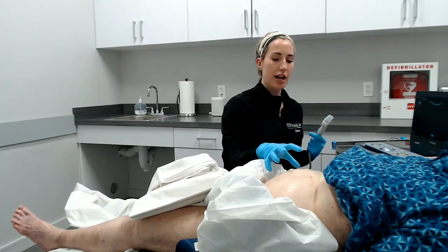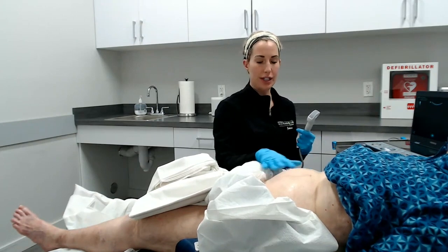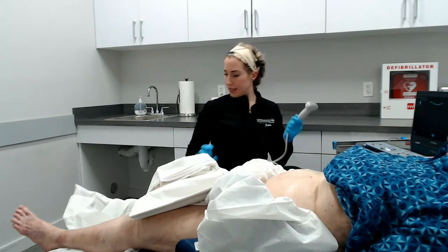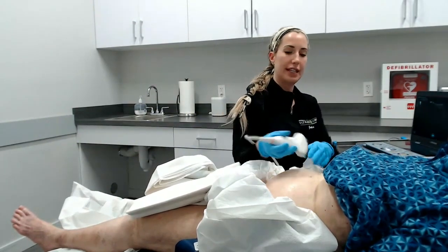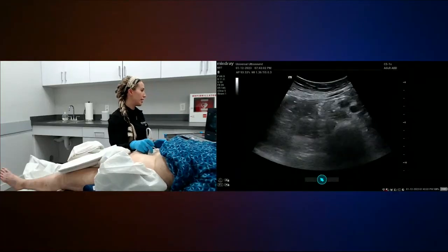So for general sonographers, you want to look where the appendix is located. So you want to look right over here, through the psoas muscle. It's always going to show you the distal. Let me just write it down. It will show you the distal inferior vena cava into the confluence of the iliac veins. So again, through the psoas muscle, I'll show you what it looks like on the right side.